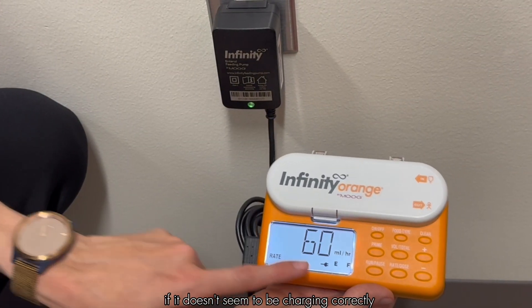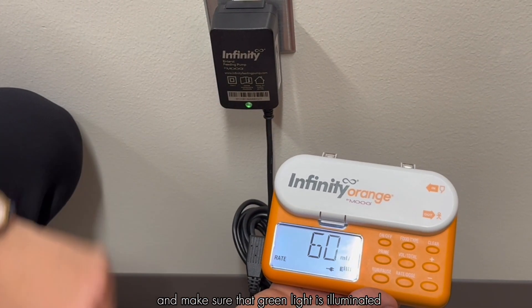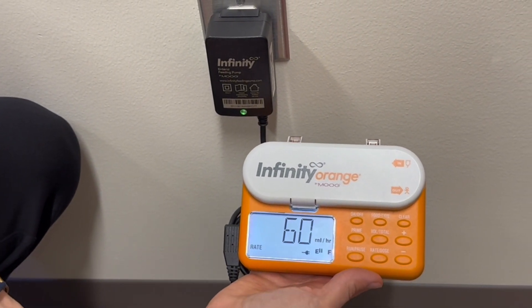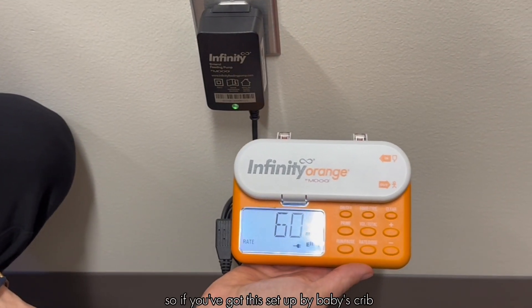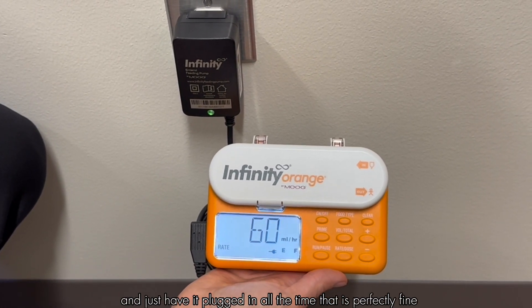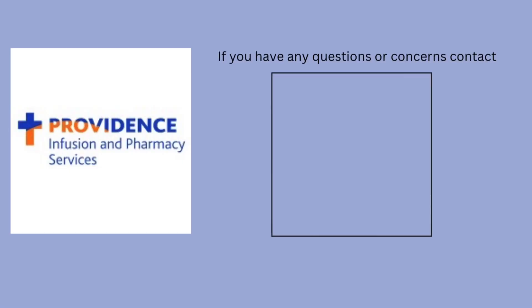If it doesn't seem to be charging correctly you can look at the charger and make sure that green light is illuminated to indicate that it's functioning. It can be plugged in while it's running, so if you've got this set up by baby's crib and just have it plugged in all the time, that is perfectly fine.